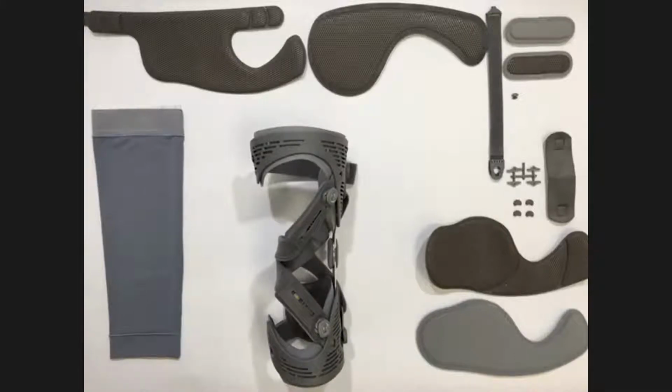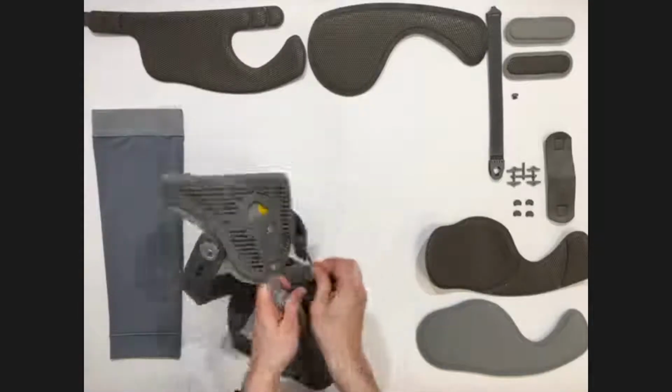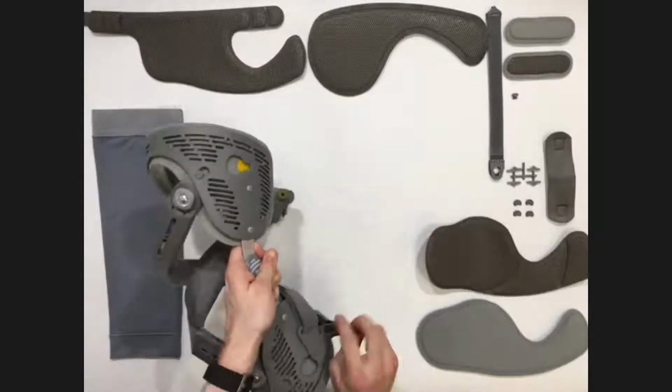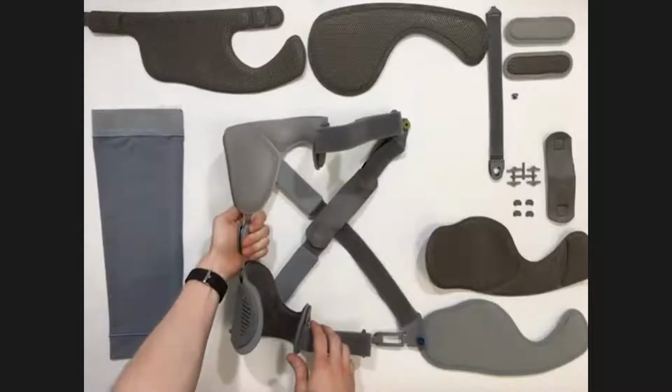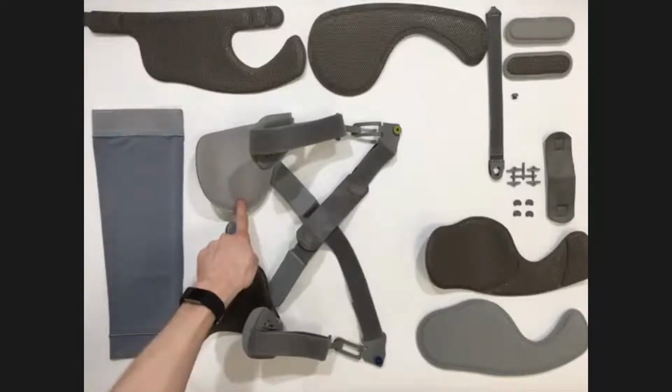This is a smart dosing version. There is an original version as well, but I'm just going to start first of all by talking through a few of the different parts on the brace. So if we turn this the other way up, you can see that we have a Sensil silicone liner here. This is a standard one as fitted on the smart dosing unloader. We also have a doe skin liner at the top.